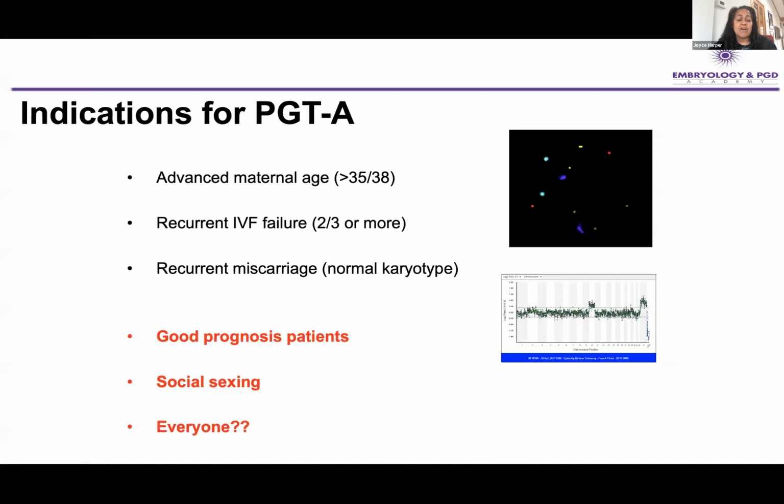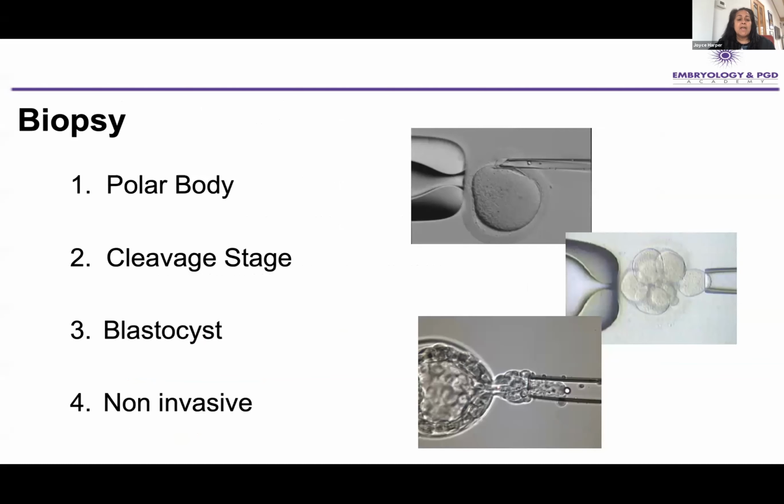So there are a number of clinics in the US now that do PGT-A for every single patient that goes through their clinic. We have a paper just submitted where we've looked at the USA data, and up until the data we looked at, there were 3 clinics doing this for every single patient, and I'm sure there's probably a few more now. So just a little bit about biopsy.